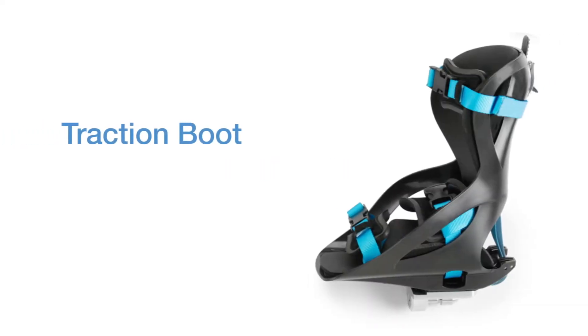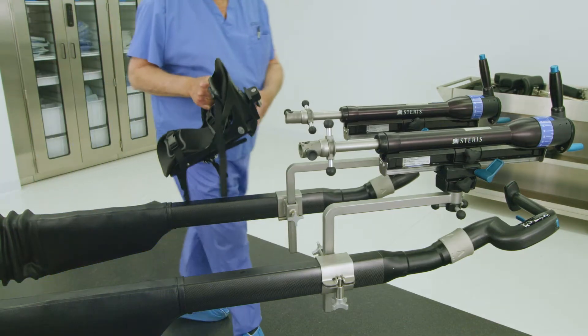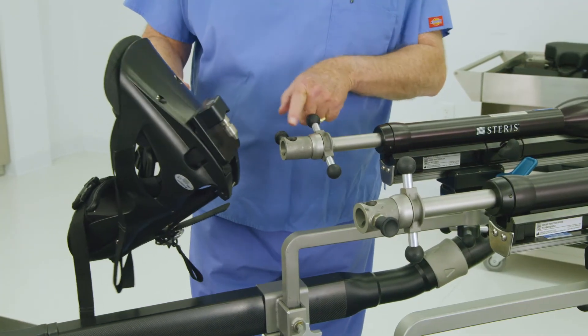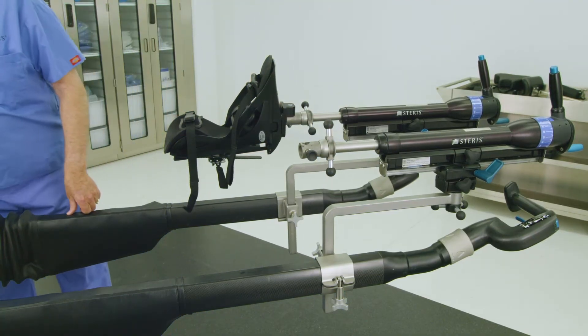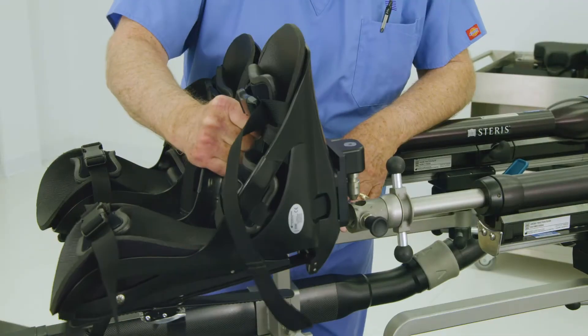The traction boots of the OT-1000 series table accommodate adult foot sizes from women's 4 to men's 14. Pediatric traction boots are available for smaller sized feet. Attach the traction boot to the fine traction assembly by placing the boot's adapter pin under the sole of the boot into the mating hole on the fine traction assembly. The adapter pin will drop in and click into place. Repeat as necessary for the other patient leg.